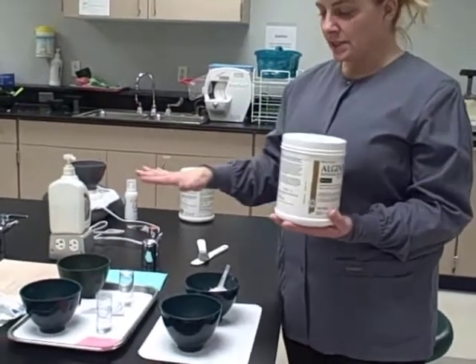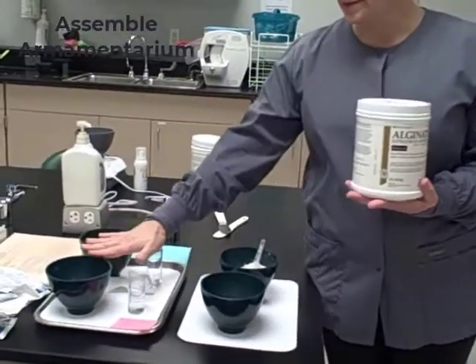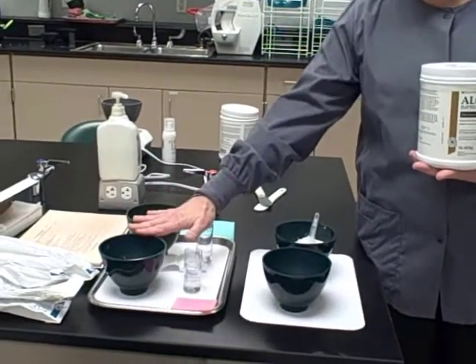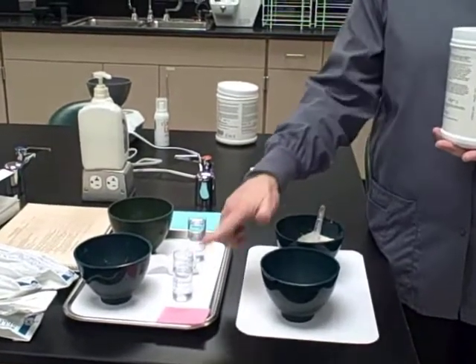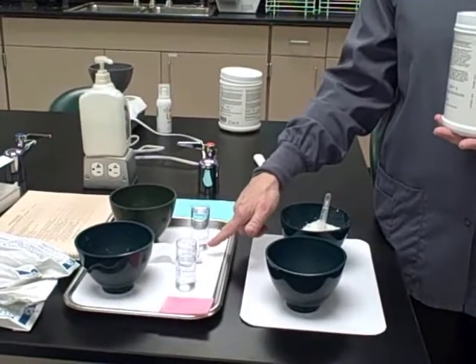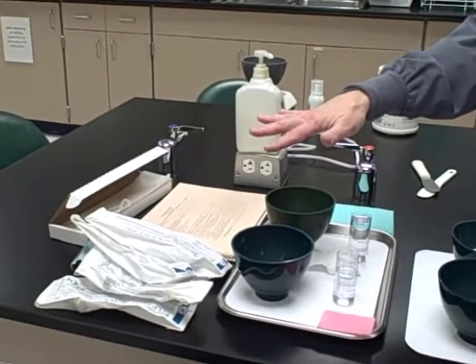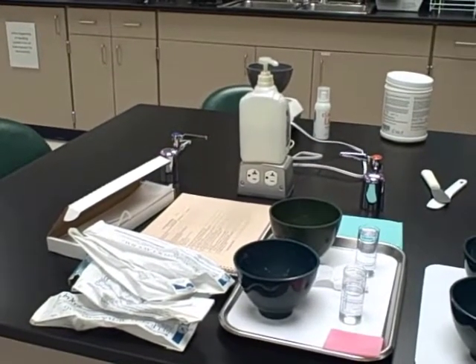We first assemble the necessary armamentarium. We have our alginate, our bowls — two bowls for our powder and two bowls for our water. We have our water measured out at room temperature. We have our wax, gauze for drying, our skill assessment book out, and then an assortment of different tray sizes, and some wax that we're going to put onto the tray.